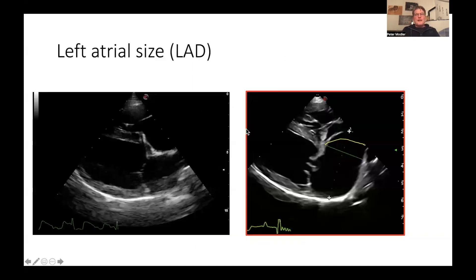Once the left atrium enlarges, the inter-atrial septum deviates towards the transducer. This would be a normal left atrium, this shows some enlargement, and in this dog the left atrium is markedly enlarged. Please be aware of the direction in which the inter-atrial septum deviates — it deviates towards the transducer in a specific way. This is important.